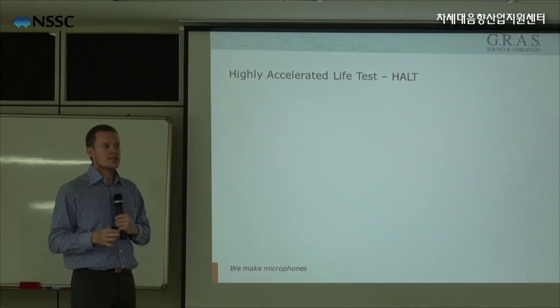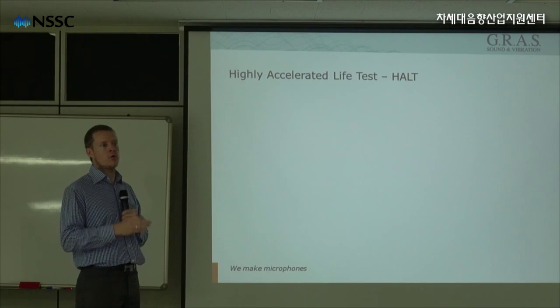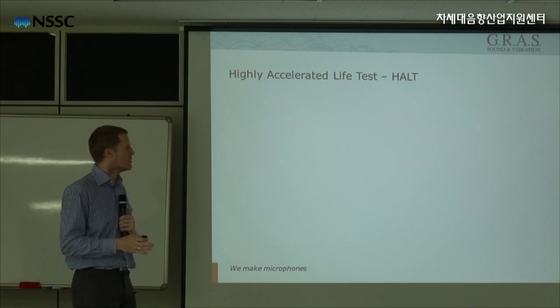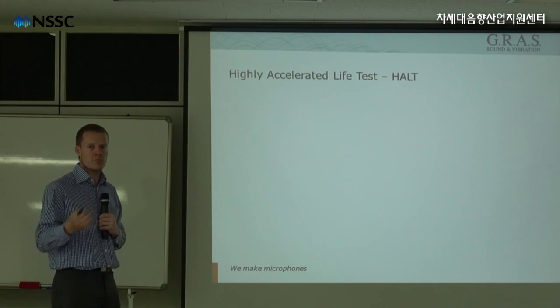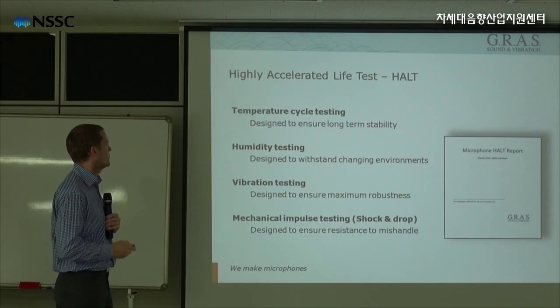The way that we are testing our microphones is done by HALT. HALT is highly accelerated life test. This is a test typically used in the consumer industry to test electronic equipment, but we have taken these tests up and applied them to a microphone in order to validate the robustness of the microphone.